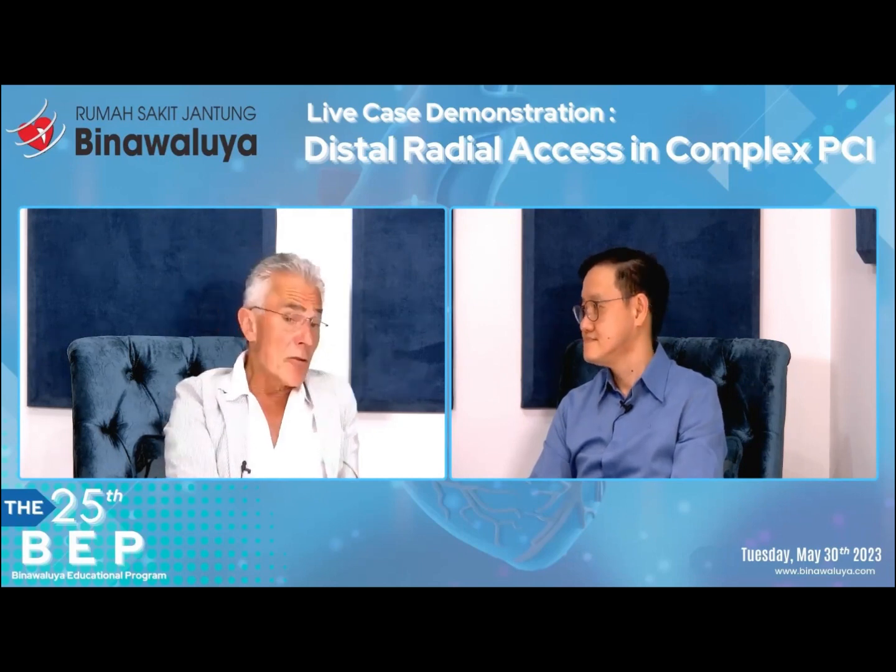From the perspective of radial arterial occlusion, here 1 hour is short enough, and you don't have total compression. So there is no rush. But if you can, and you need to observe the patient after a complex procedure anyhow for some time, that's why I think you should consider also other factors.